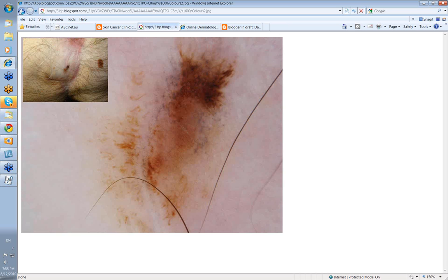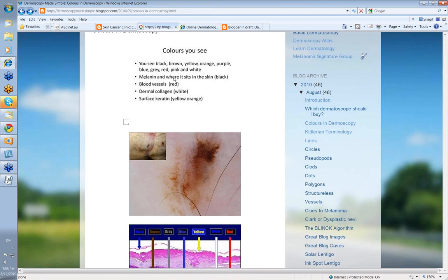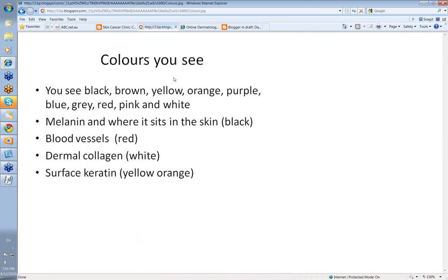So what's the inference of these colors? In dermoscopy we comment on these colors: black, brown, yellow, orange, purple, blue, grey, red, pink, and white — if you consider white a color. That's a fair spectrum of colors that you're going to see in lesions.